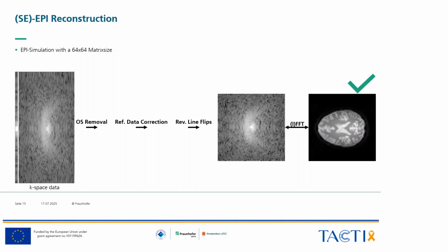In principle, this is also only half true, because for EPI to be more efficient, you can also introduce something which is called ramp sampling. So instead of only sampling data at the plateau phase of your readout gradient, you would also sample data during the ramp phase of your gradient. And this would require you to regrid your data to an evenly spaced k-space grid, and this is quite common to be applied. So this is also integrated in here directly or in the reconstruction. But if you would not do that, you would basically end up with images which look a bit distorted.